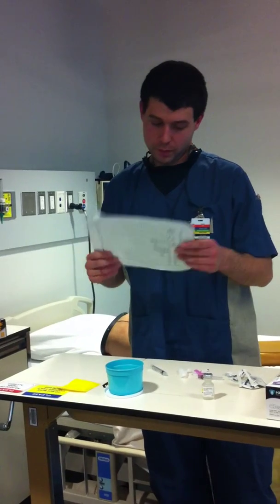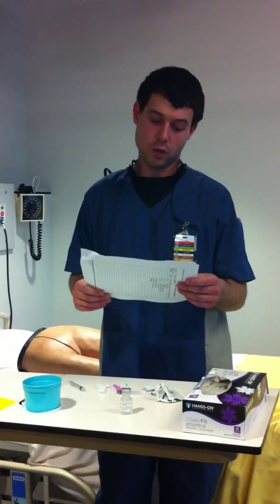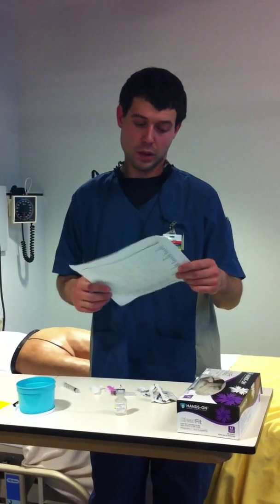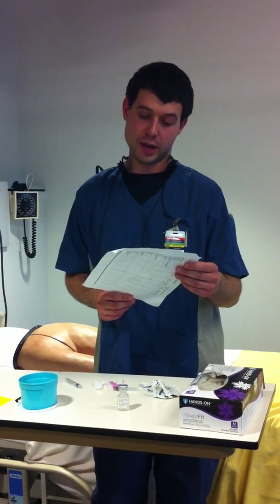Hi, my name is Ben, and I'm going to show you how to administer an IM injection for our patient, Mr. Tutu. The first step is to check Mr. Tutu's MAR against the prescriber's order. So, on Mr. Tutu's MAR, we have Fluvarin, 0.5 milliliters, IM, one time only. Against the prescriber's order, Fluvarin, 0.5 milliliters, IM, one dose.